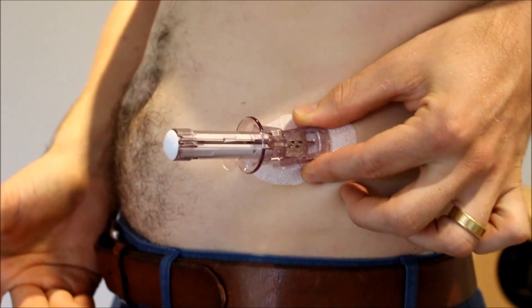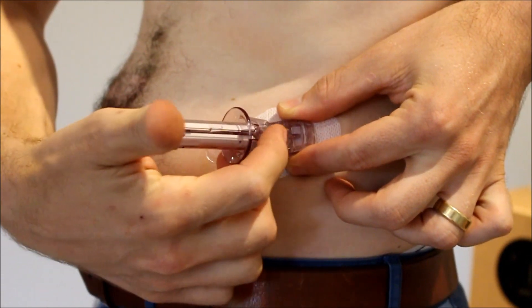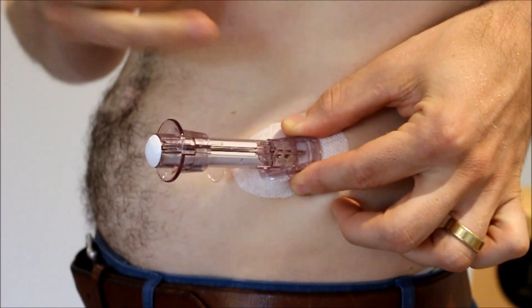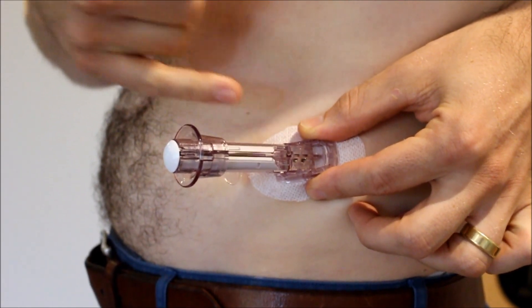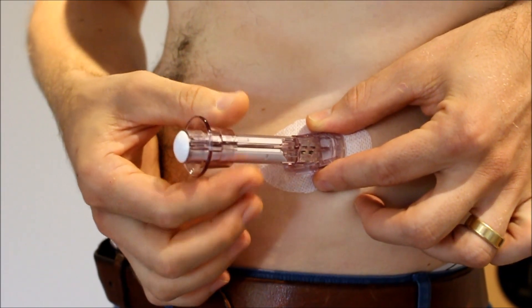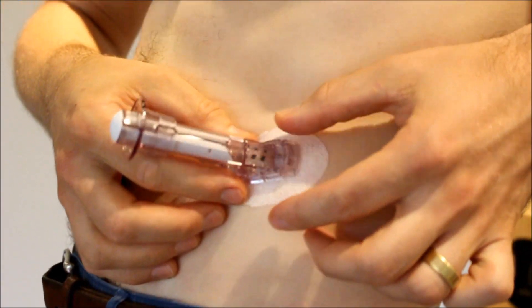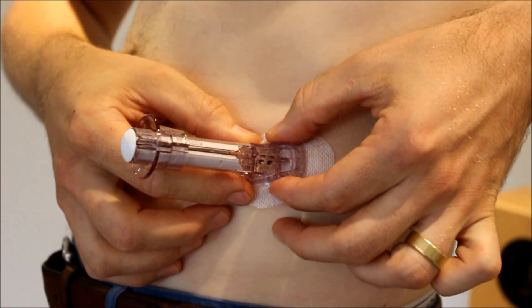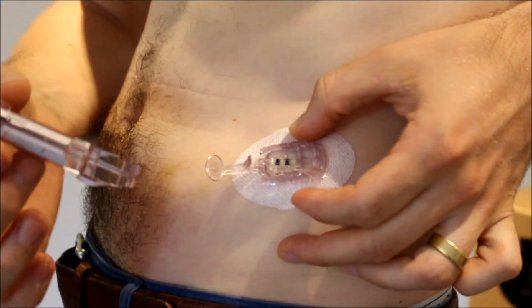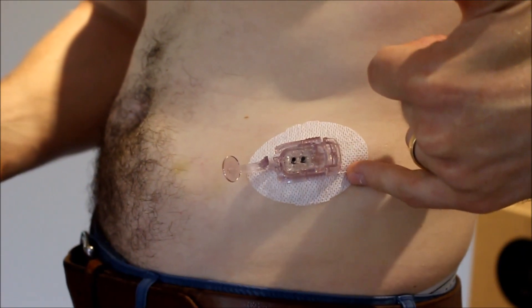Now we've got the needle in the skin with the filament. So now what we want to do is get our fingers over the little flange here and pull it all the way back like that. The needle is now out of your body — the filament, the sensor, is now under your skin. The next thing we want to do is take this part of it off and just leave our little brace there for the transmitter. If you can see up the front there, there are two little grippy bits. If you squeeze them in and then push this up, it'll come straight out — no fuss whatsoever. And there we have our sensor installed on the body.